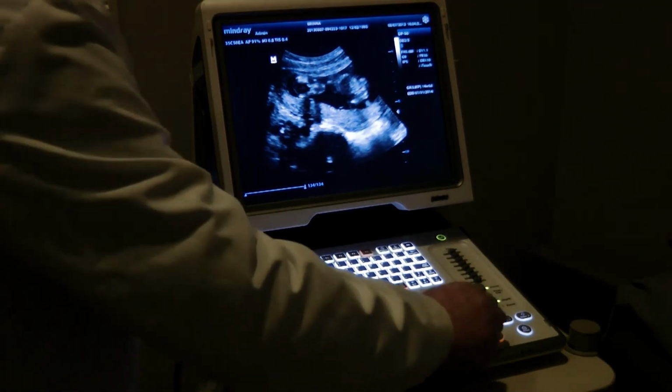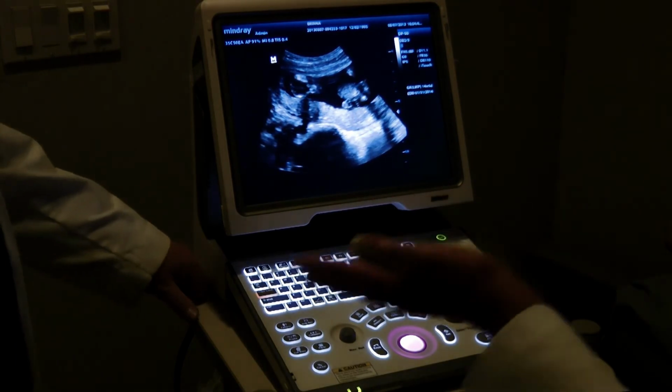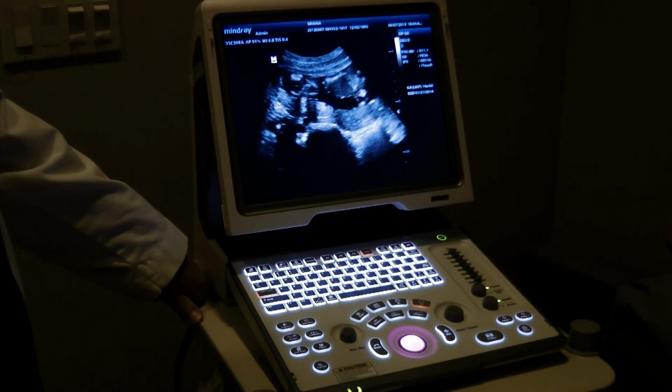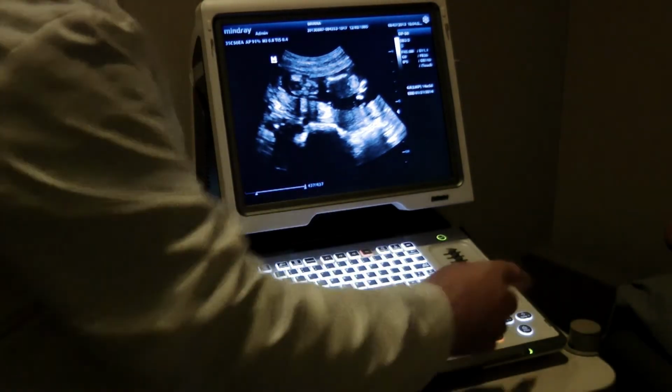All right, Brianna, we just got that baby kicking for you. I love that. So if you get anything going on, you don't have to worry about missing it. Right. And right now he's kicking and moving. His mouth is wide open. So let's capture that. Capture that, exactly.